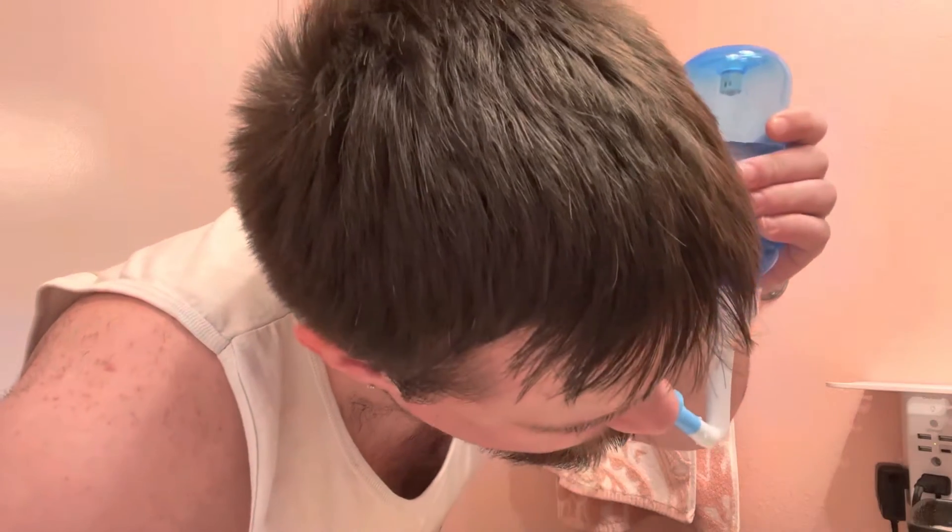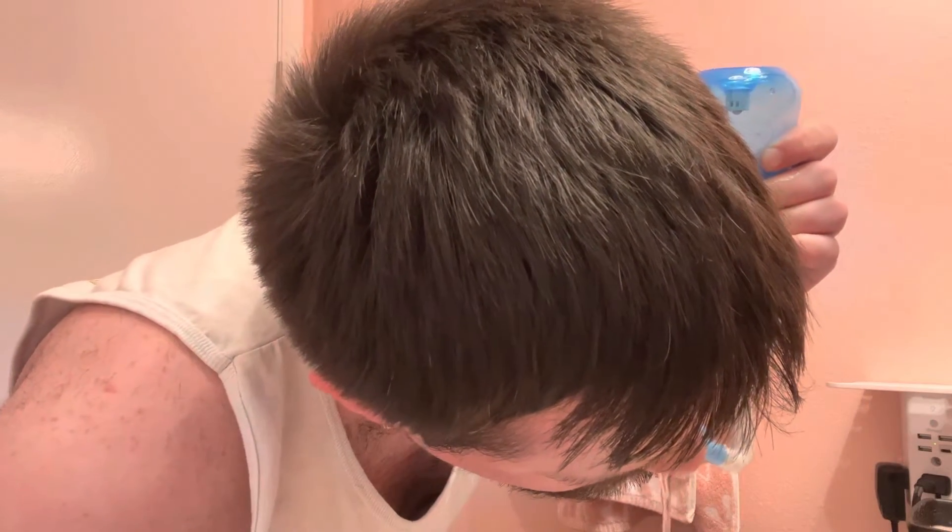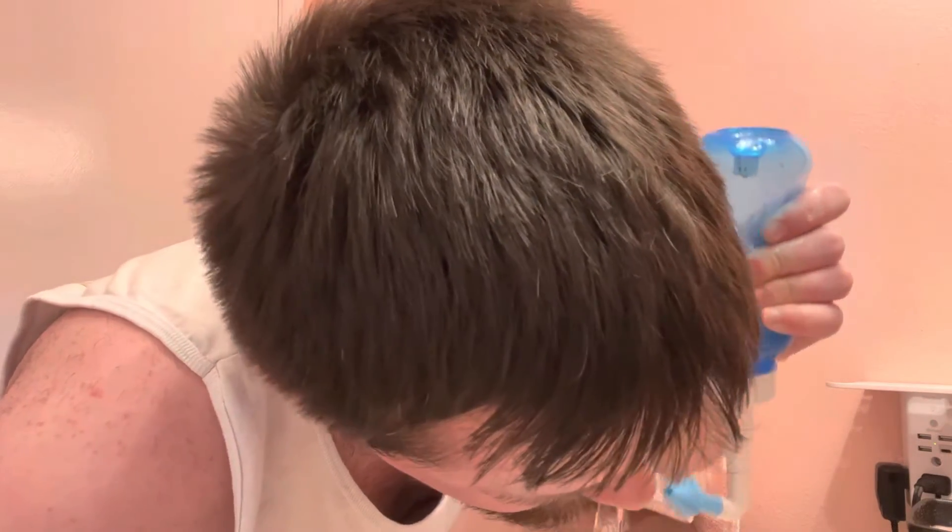Is it working? Kind of — my nose feels a little bit clearer so far. Let's do it the other way. It feels so unnatural. Your body doesn't like it. It's like, hey, this is how you drown.